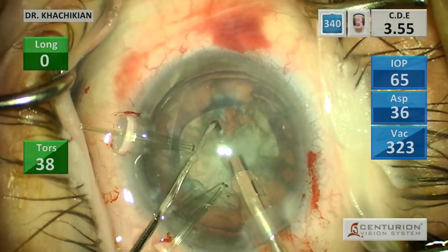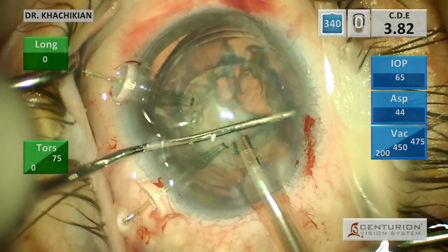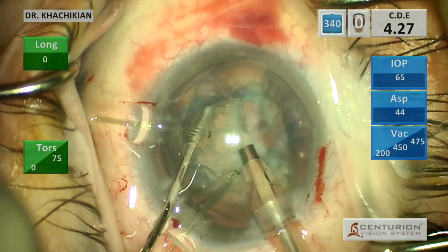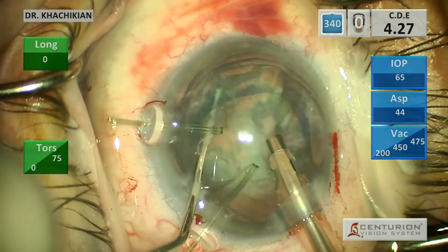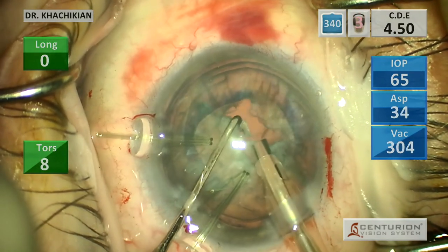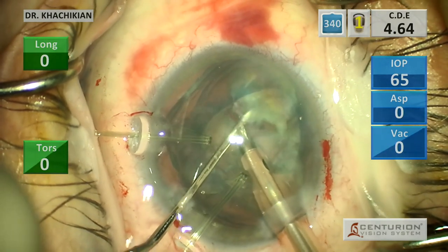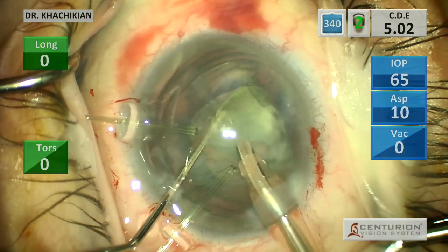McCool once said: how do you know when to use capsular hooks? And his answer was, when you think about using them is the time to use them. So that's sometimes a good rule of thumb. We've gotten half the lens out. Notice there's minimal manipulation and most of the chopping is done without rotating the lens - especially on that first half, I try to chop. It's a good consistency lens to chop, and I'm trying to chop the lens without rotating it, and it chops nicely.